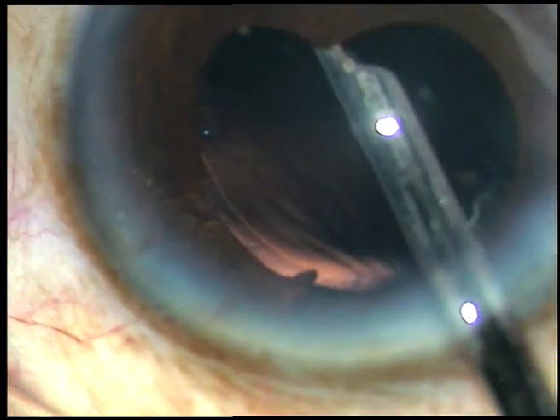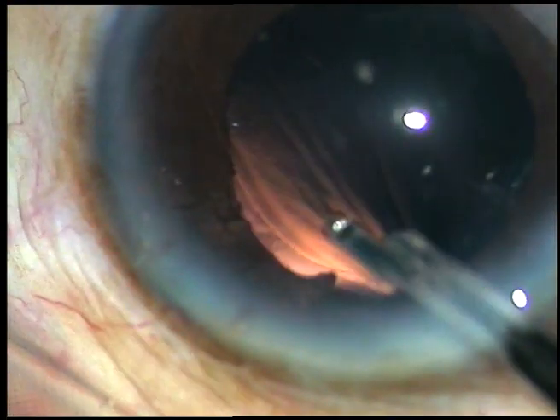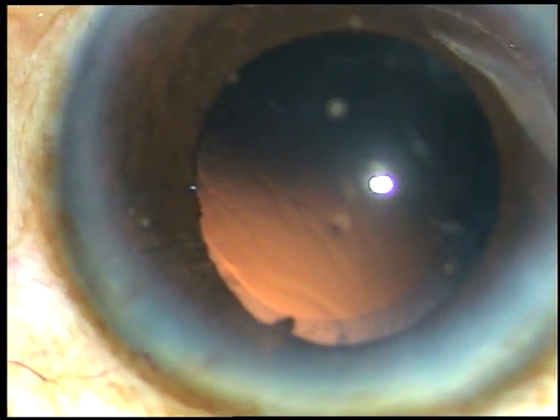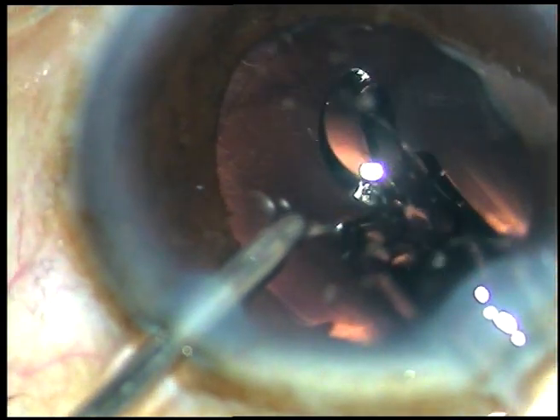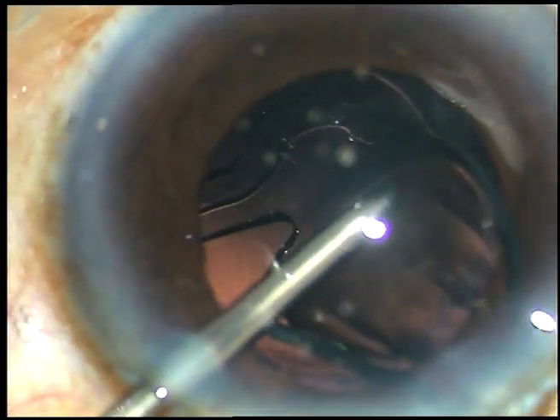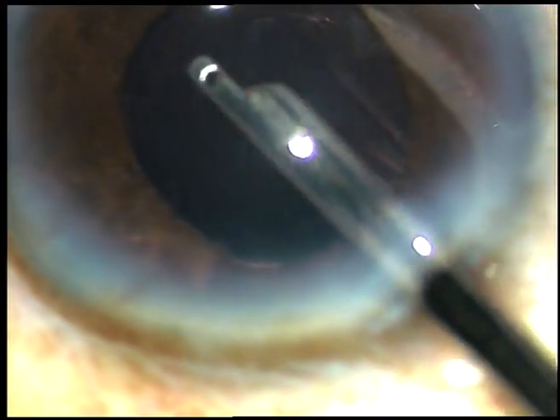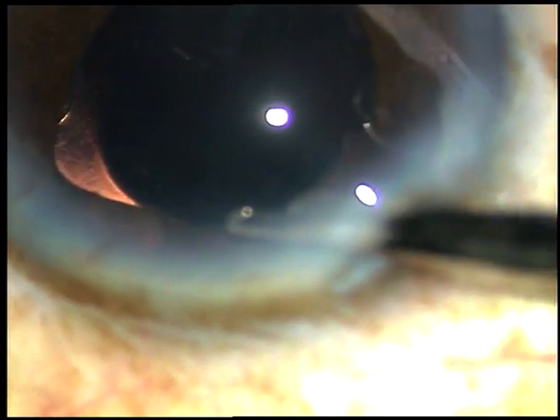Now is the time to implant an intraocular lens. In this case we have selected a hydrophilic acrylic intraocular lens, and it is going to be implanted with the anterior chamber formed under irrigation — no viscoelastic substance is being used for implanting the lens. The irrigating probe keeps the anterior chamber formed, then the lens goes into the anterior chamber and then into the capsular bag. This portion of the surgery is edited. The lens is placed in the bag, the side ports are hydrated, a final lavage of the anterior chamber is done, and the case is concluded.